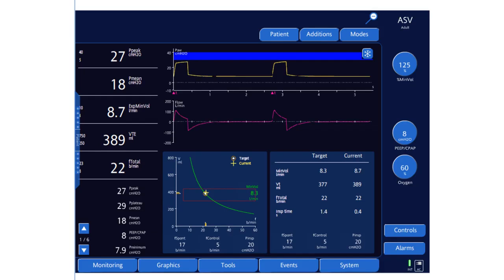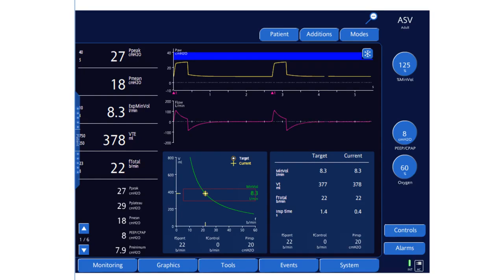This is a volume-supported breath, meaning the pressure support will vary up and down to achieve the target. The patient's own inspiratory rate is now 21, and the machine is contributing zero mandatory breaths. The inspiratory pressure remains at 20, and targets are being achieved with volume support. If the patient breathes at a rate lower than the target of 22, the machine will go into P-SIMV, delivering mandatory breaths while allowing volume-supported breaths in between to maintain 8.3 liters per minute.